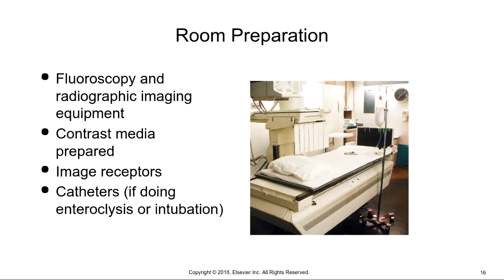As far as prepping the room, it's kind of like anything else we've talked about as far as contrast study goes. You want to make sure your fluoroscopy is set up and your imaging equipment. We do need a scout for this particular exam. You would have to take a scout abdomen prior to giving the patient any contrast media, because remember, once you give them contrast, you can't go back to having an empty abdomen.